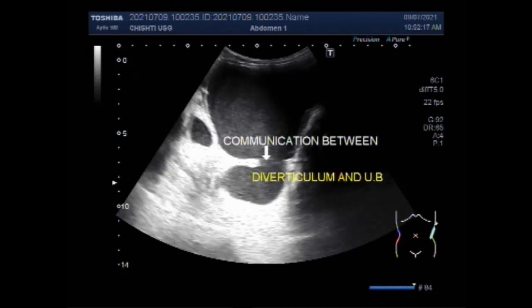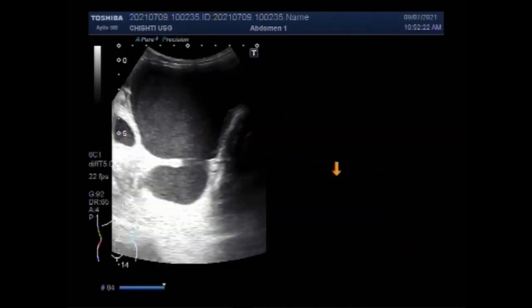Now again you can see the communication between the urinary bladder and the diverticulum.